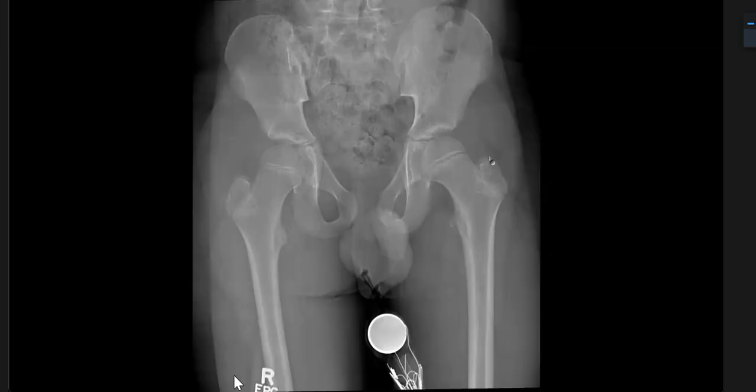In the MRI request card is a child. Obviously the patient would probably need a general anesthesia to go through the MRI. The child will not sit still in the MRI. So obviously you are sending this child for MRI under GA. It's quite a big ask, I would say.